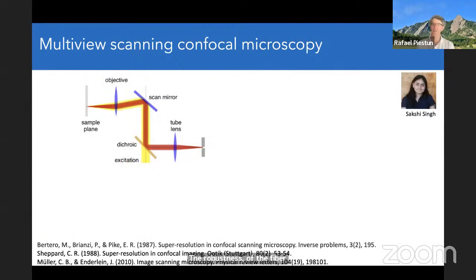Okay, another thing. As I mentioned, you can consider the fiber as an objective, and you can think of performing basically any imaging modality you know from microscopy through the multimode fiber. And in particular, we have been interested in super resolution. So we try to develop this multi-view scanning confocal microscopy translated to the multimode fiber.